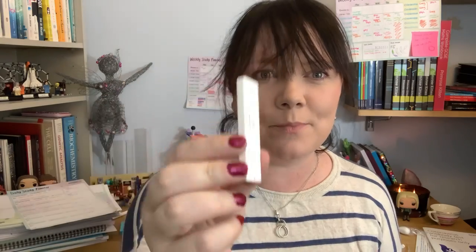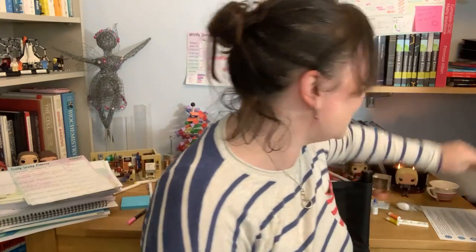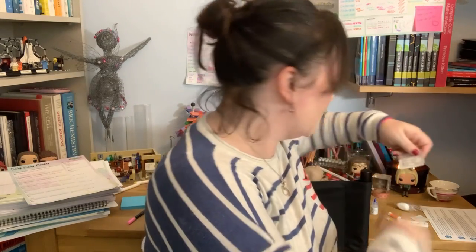So this is the test here. I'm going to do it here. I've read the instructions already. I would like to say I know what I'm doing — I did use to work in a lab, so I'm quite used to doing labby things. It took me a while to find the instruction booklet because it's this massive leaflet, which obviously I'd just ignored. But this is actually the nine-step leaflet. And then we need to clean my finger with the alcohol swab.